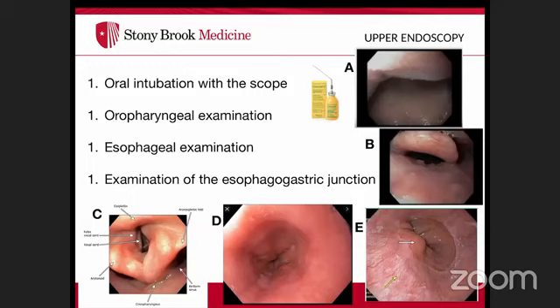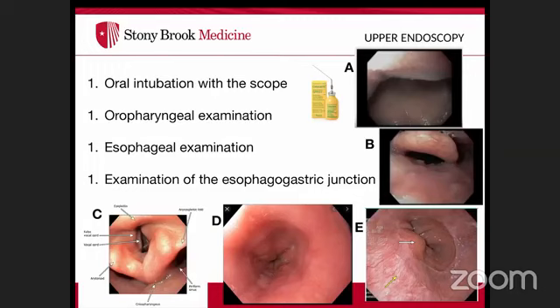Identify the GE junction and the Z-line, which represents the transition from squamous mucosa of the esophagus to columnar epithelium of the stomach. Note the appearance of the Z-line — whether it is regular — and document its characteristics.